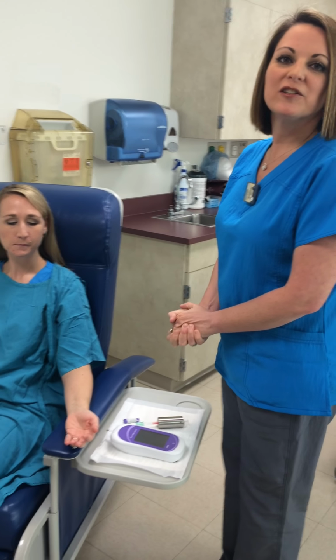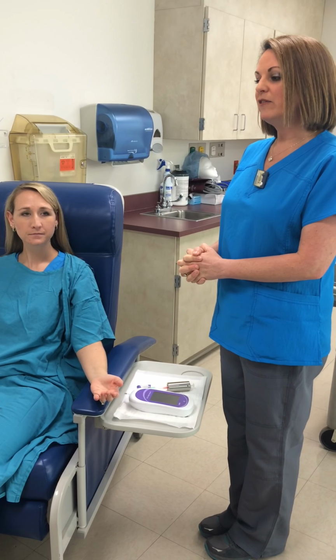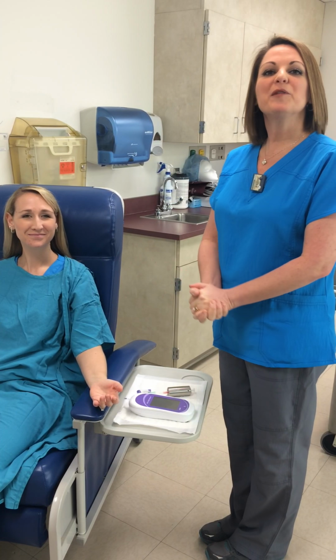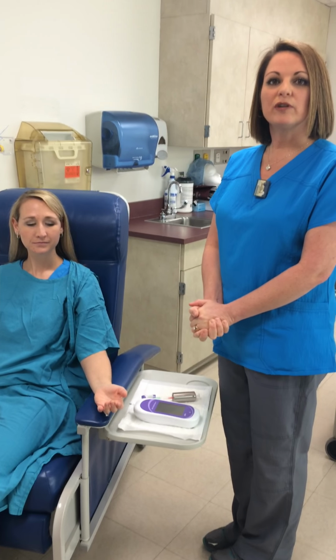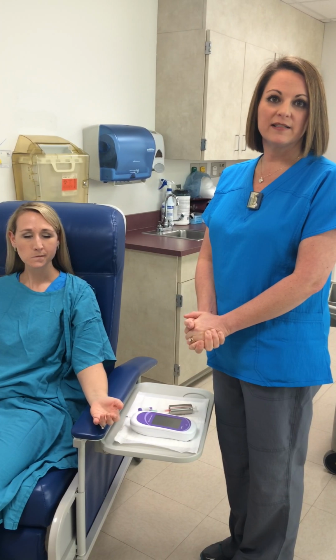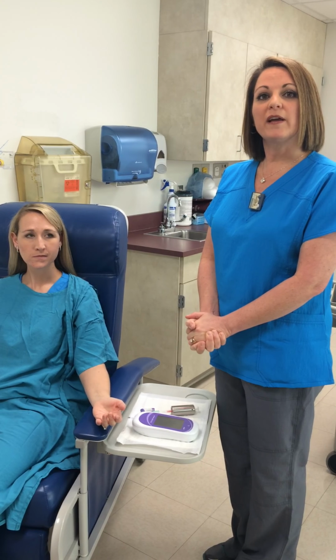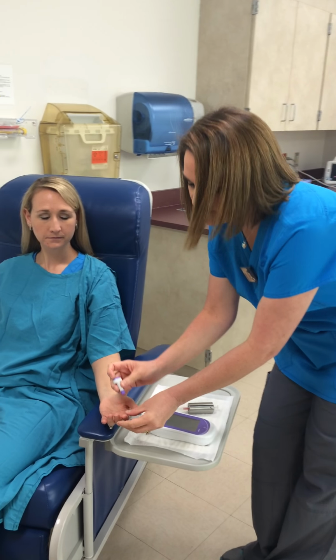The first thing the technologist does is make sure that the patient has followed the preparation instruction of not having anything to eat or drink in the last 4 hours. It's very important that they follow these directions. If a patient has had anything to eat or drink, it could affect the accuracy of the test. It can make the body process what they have had to eat instead of the injection that we're using to look for cancer. The first thing we do is check the blood glucose level.